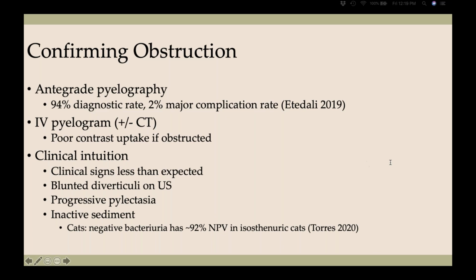Larry brings up the concept that, prior to ultrasound being readily available, when there's an acute obstruction, it might take 5 days or so before you're seeing that progressive dilation, especially when it gets to the ureter. And that's true, you need time to allow everything to become dilated. So it could be that it's just too early and you're not seeing evidence of the obstruction. So those are some things that I'm looking at when I'm trying to evaluate whether they have pyelo or whether they have an obstruction, which is very commonly the situation that we're in.